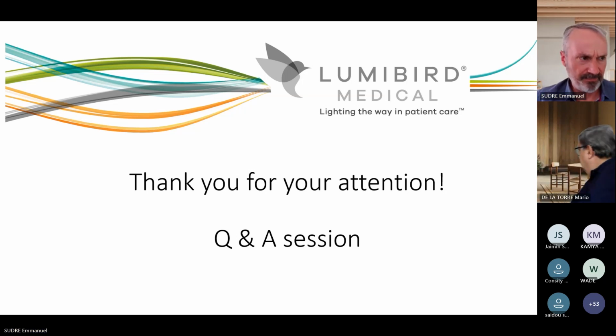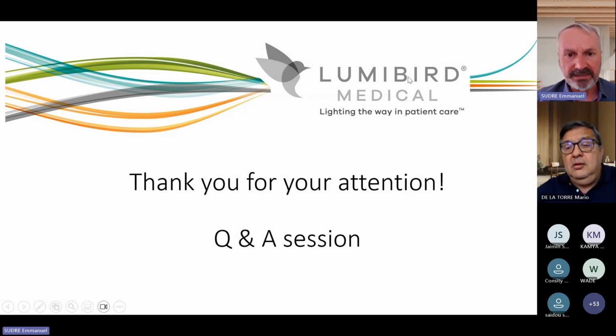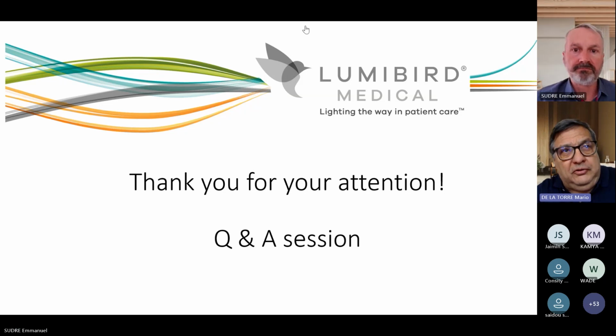So, Professor Mario, if I am wrong, correct me. And there is another factor also. As you already said, SLT is well proven, well known, with a lot of scientific evidence. And this is important also in terms of investment. When you have an SLT unit with a YAG laser inside, you have the double option.